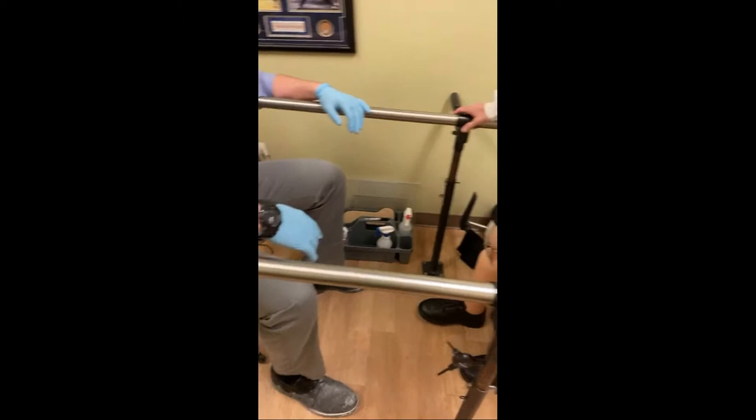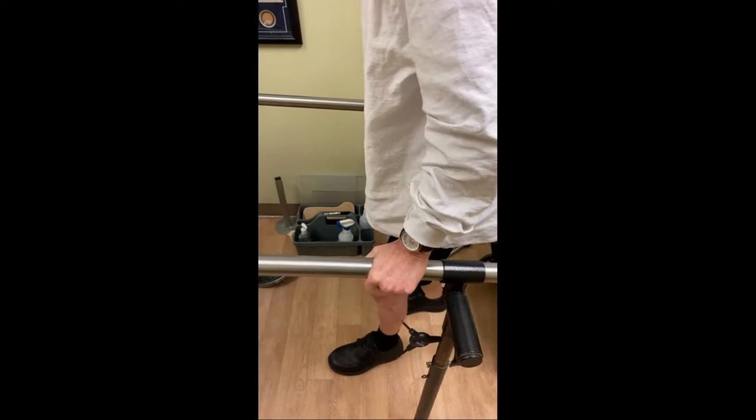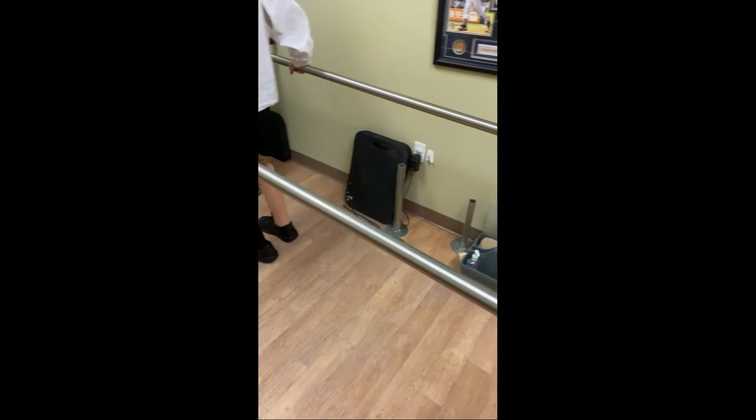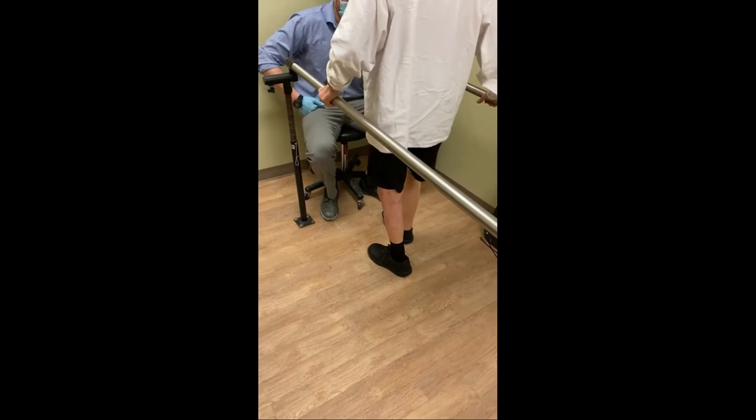So let's see how we're doing. How does that feel — the knee locking a lot better? Much better. Look at that — this is the best I've seen you do. I can't even use the walker. Good, let's turn around.